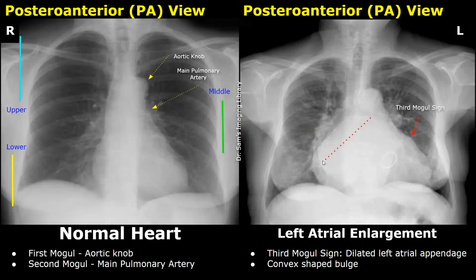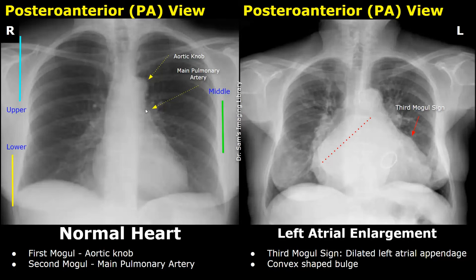The third mogul sign refers to a convex-shaped bulge due to the enlarged left atrial appendage, which may be seen in the setting of left atrial enlargement. The first mogul is the aortic knob, the second mogul is the main pulmonary artery, and the third mogul — this convex bulge — is not present in normal cases but appears in cases of left atrial enlargement.